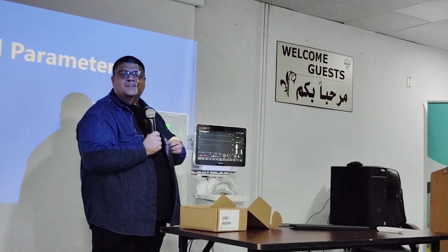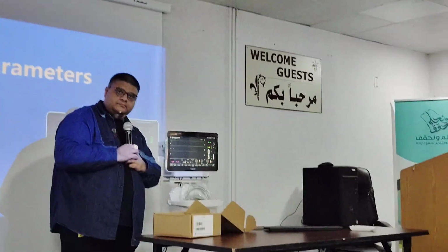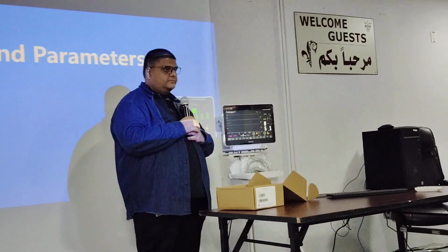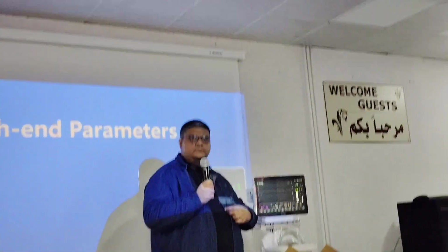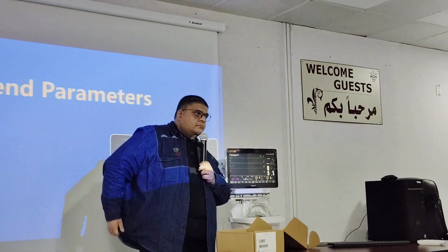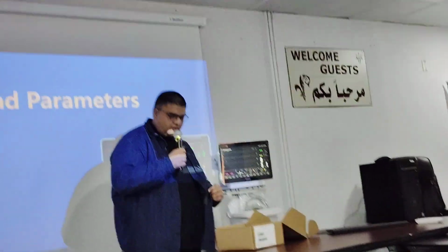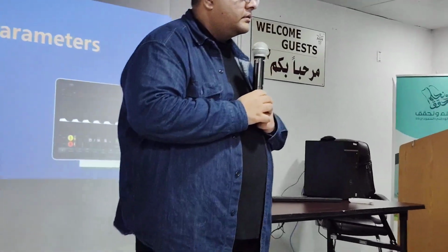Where's the engineer? Some monitors for EMS, the BioLite monitor, they did not give us the pediatric sensor. Okay, SpO2. They should, because it comes with the adult and pediatric, with each device. But you cannot remove that one, sir. Not like the Mindray, where you can remove it and put another. That's what I'm always asking the biomed. And it's not compatible, the one they're giving us. They know each one has its own wire.